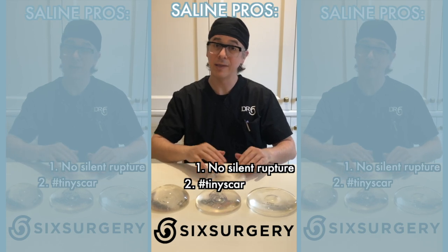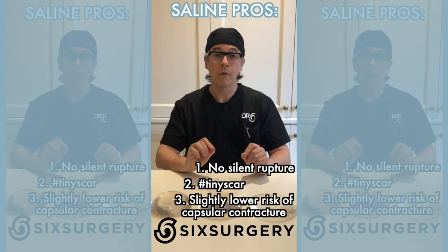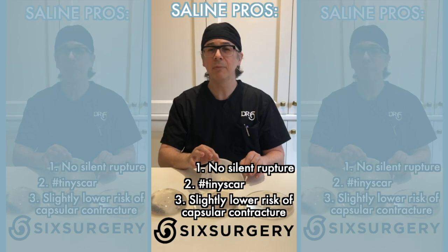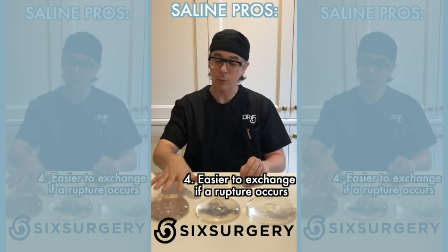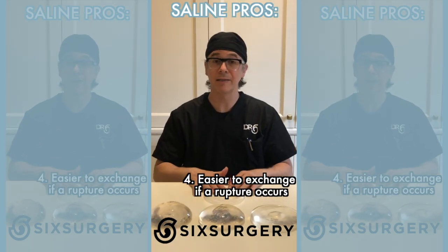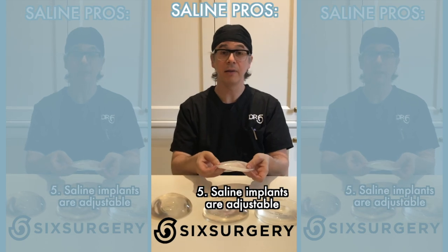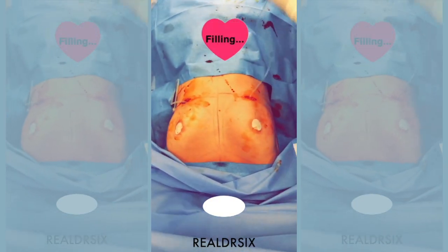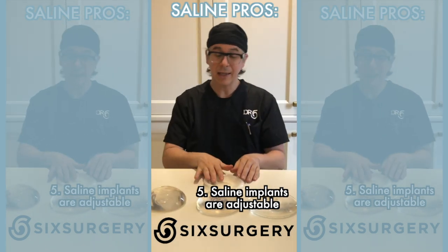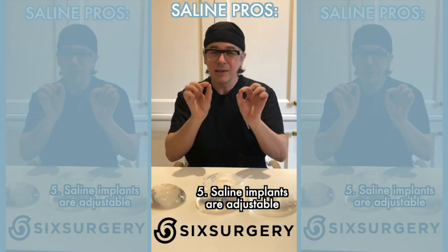There is also a slightly lower risk of capsule contracture with saline implants compared to silicone. If you do have a rupture, it's easier to exchange — you simply take out the ruptured bag, put a new one in, and fill it up. With silicone, you may need to clean up any silicone that leaked out. One other thing I like about saline implants is that they're adjustable. Because I fill them at the time of surgery, I can make fine adjustments — just a little fine-tuning. Silicone comes in set sizes like 360, 380, 390. Saline allows me to go 360, 361, 362, 363 — a small difference, but it gives me just a little finesse to get it just right.